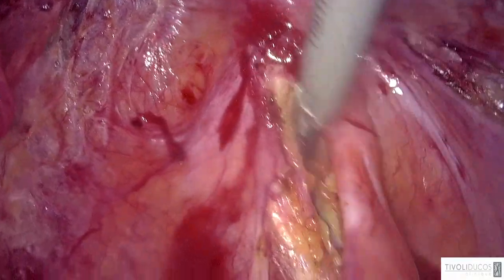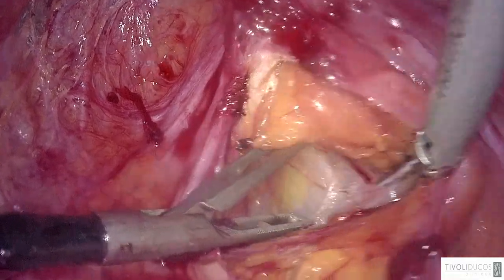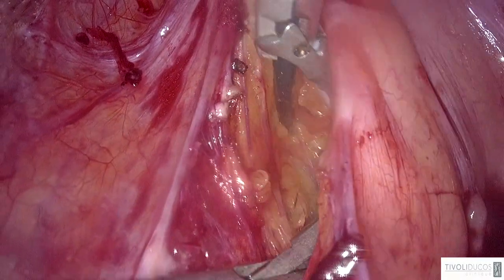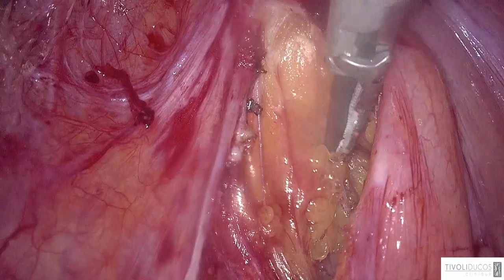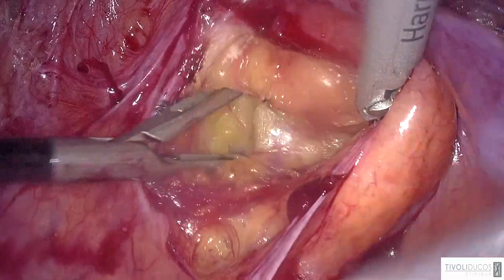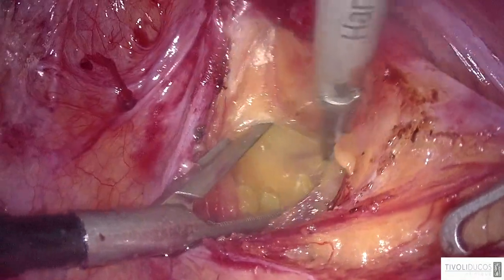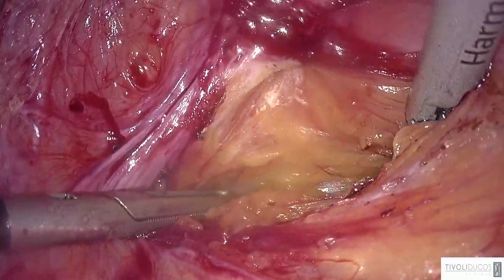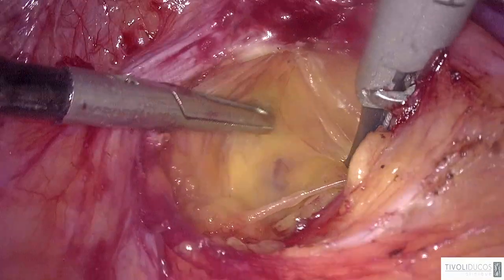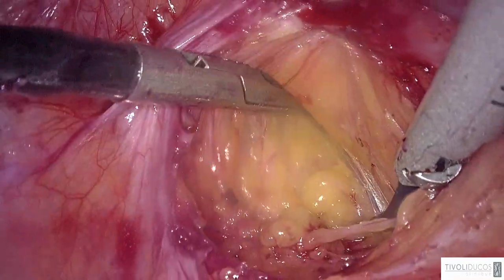So you see the rectum is here. This is the rectum. So I have to go closer to the rectum, and to reach the rectovaginal space on the left side, where it is not involved. So we always try to start by dissecting the rectovaginal space on the side where it is less involved and where the anatomy is easy to recognize. Okay?